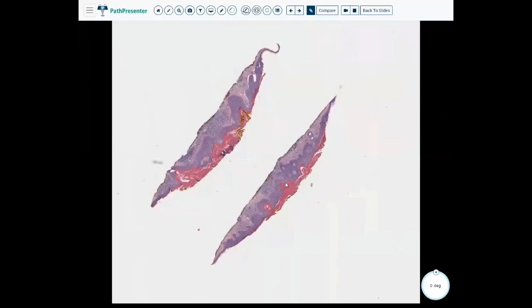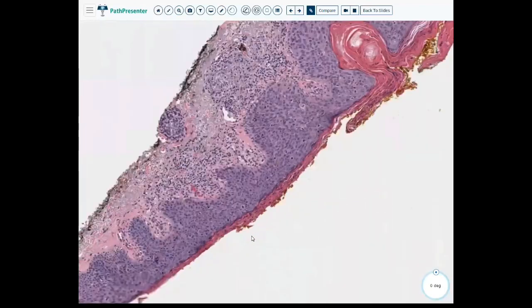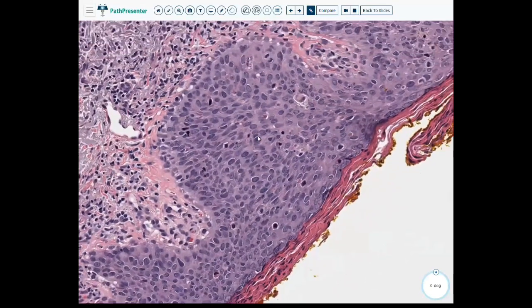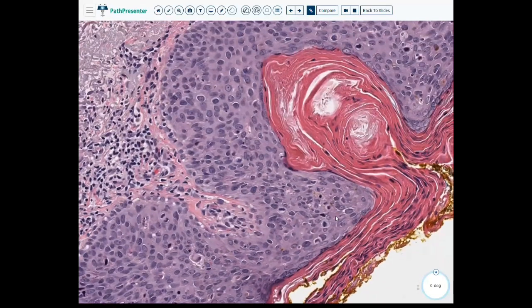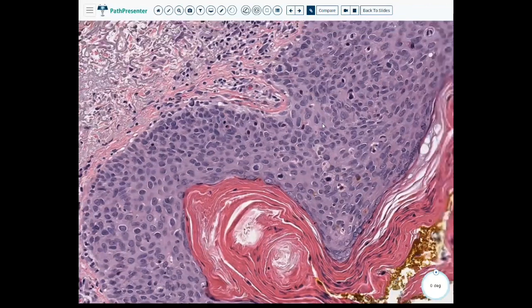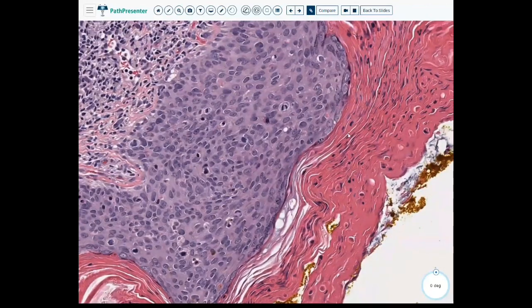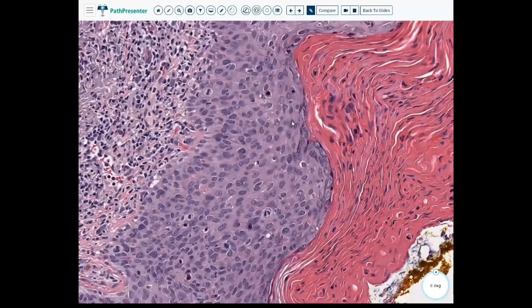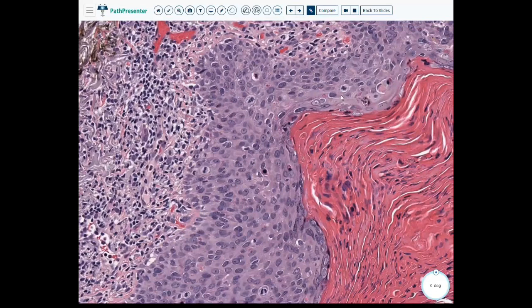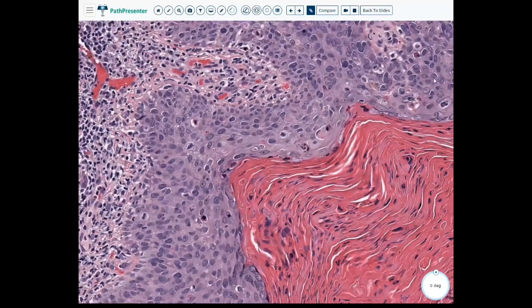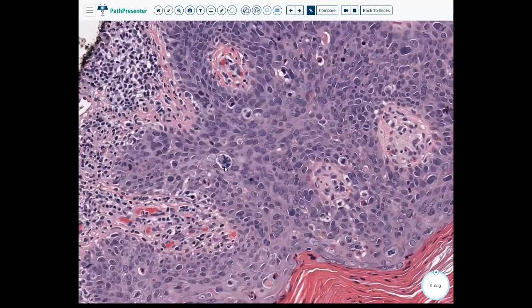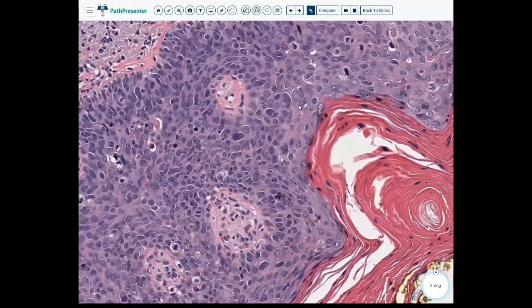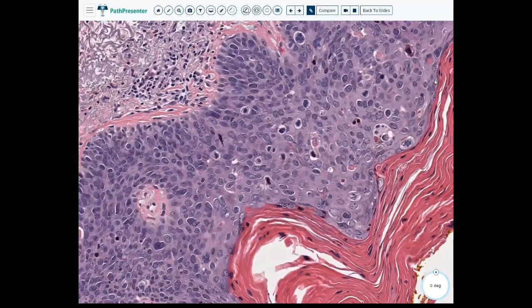Case thirteen. This looks like we have acanthotic squamous tissue with all these atypical cells — no real order to what's going on here. Look at that mitotic figure — it's really high up. There are some dyskeratotic cells, and another mitotic figure at the basal layer. This is an abnormal mitotic figure. Apoptotic bodies. Look at this one — it almost looks like Caput Medusae, like snake heads coming out. Very atypical, involving the entire breadth of the epidermis.